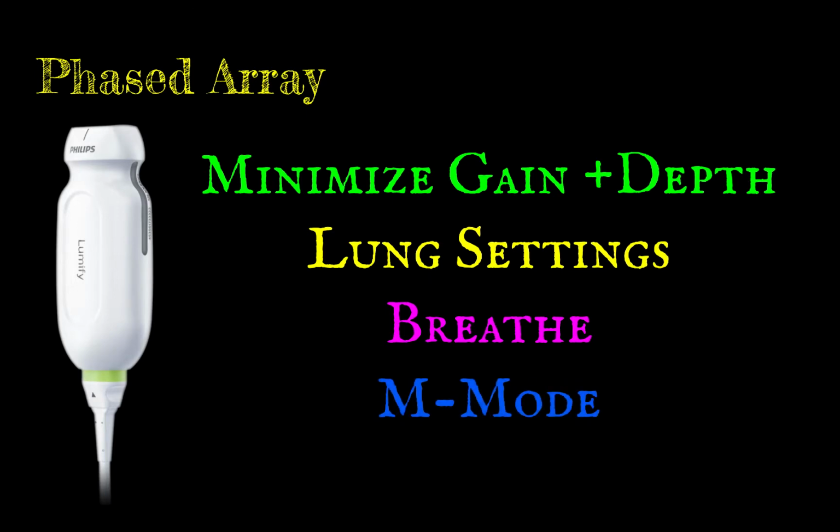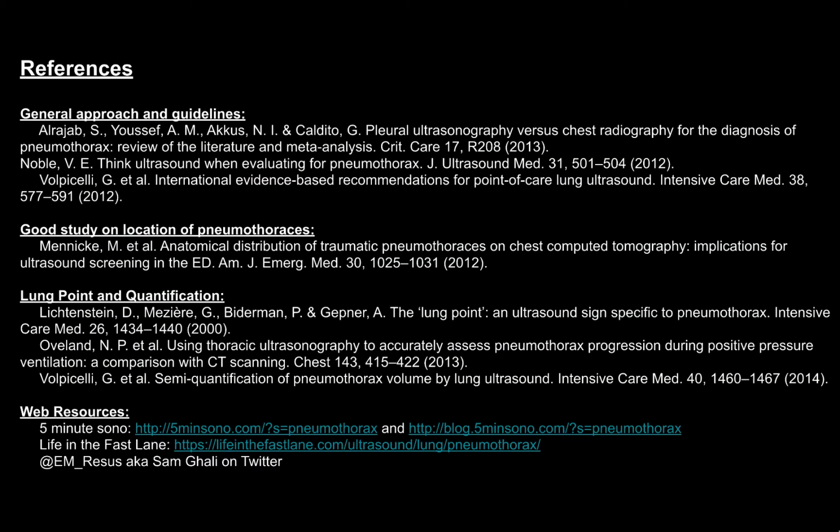For the time being, we'll continue using only the phased array probe. If this isn't working out for us though, we'll definitely readdress and consider getting a separate linear probe. So keep your feedback coming. Here's a few resources for you to review.